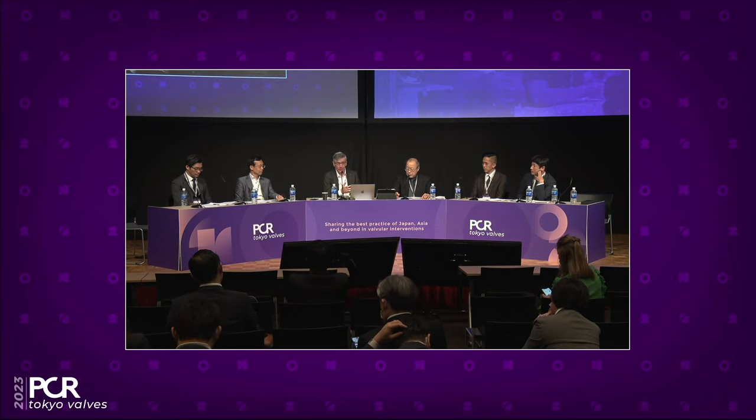So I think it's still a little bit challenging with some of the platforms because the valve was actually not designed for it. If you go two years back, very few people were talking about commissural alignment. Now everyone is doing it. So companies are fully aware of that, and I think you're going to see a big move forward.